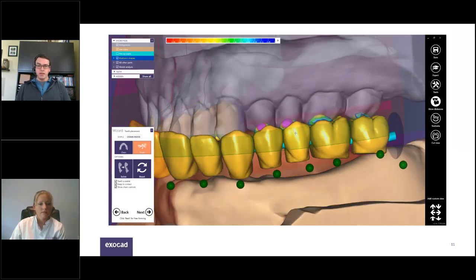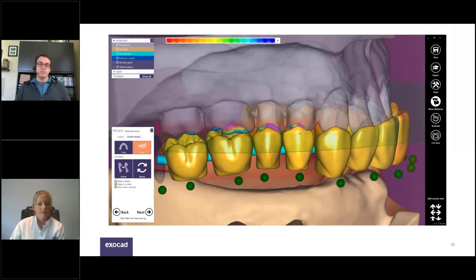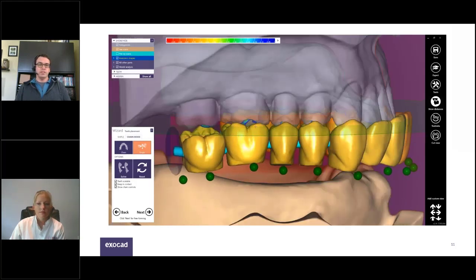That's showing us our position in relation to the opposing skin, whether we're sticking through the opposing skin or if we're too far away, if there's no color on there. So a really useful tool for helping us guide our adjustments here.